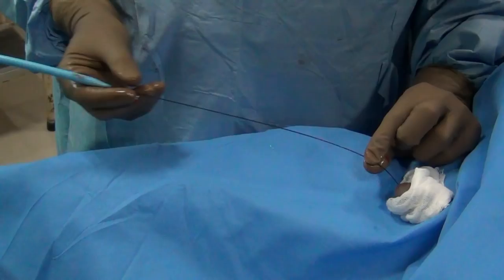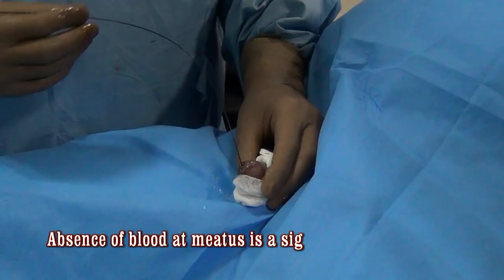If you want, at this stage you can thread a catheter over the wire, but most patients do not need a catheter if they do not bleed.